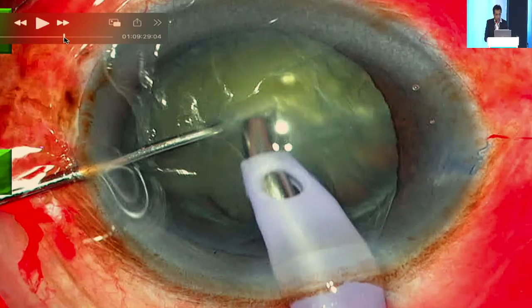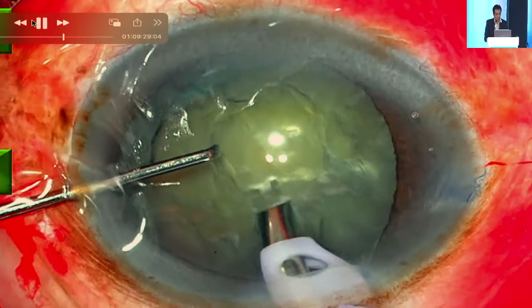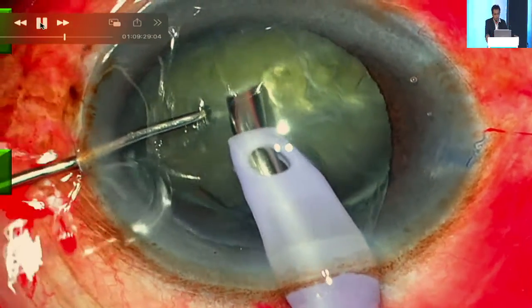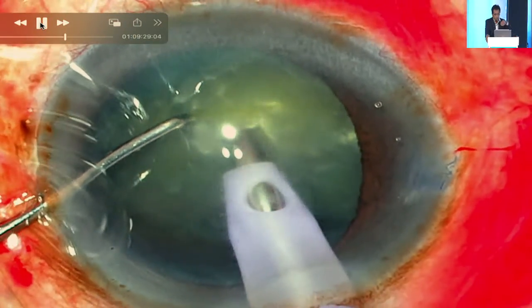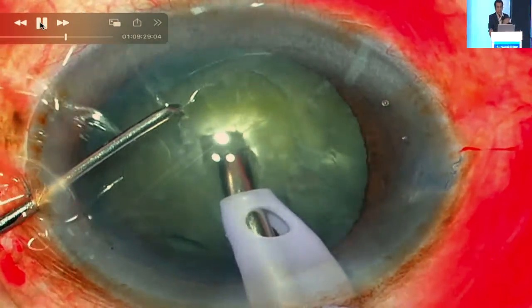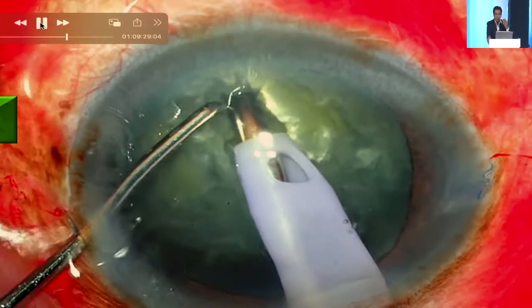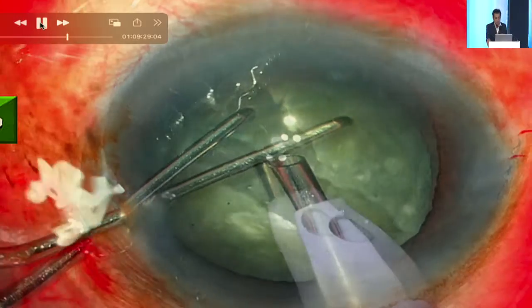Now, quickly, can I move into some of the conceptual errors. This is a trainee surgeon who has come, who has probably done around 100 or 200 phacos already. But look at the way the sculpting is being done. The nucleus is being literally pushed at or shoved at, okay? In spite of doing so many cases, they have not reviewed their own cases. These are the mistakes they make.